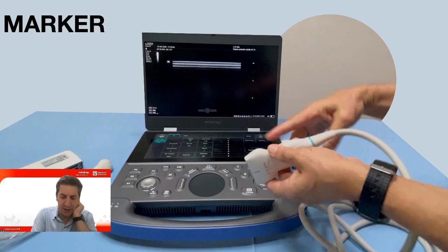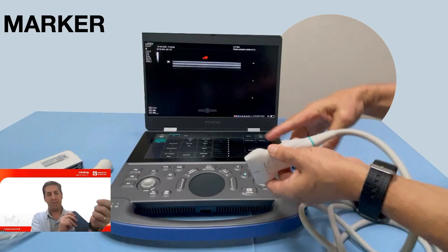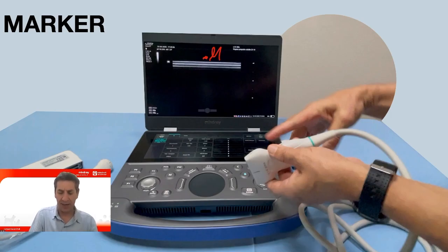This one, this one, this one, and this one. This point is always the place where I put the probe. For instance, if I put the probe here, this is the medial aspect of my arm, okay? So this will be medial. If this is medial, this is lateral.